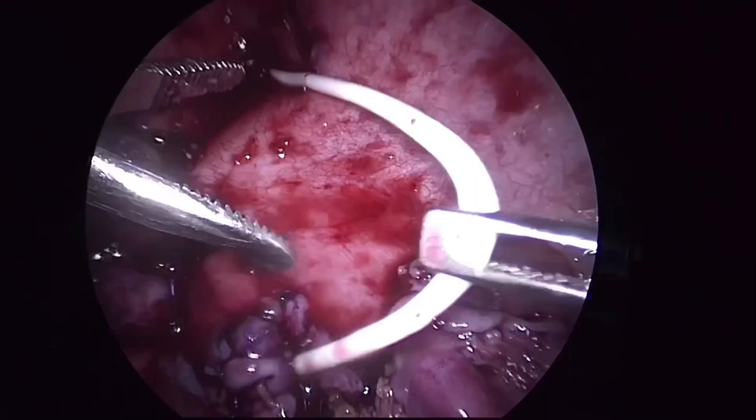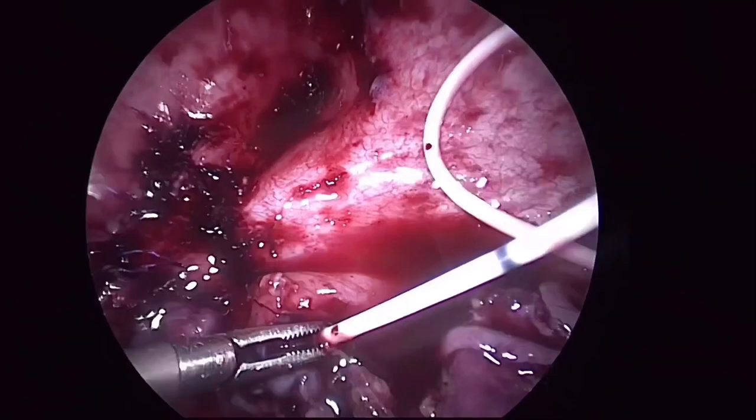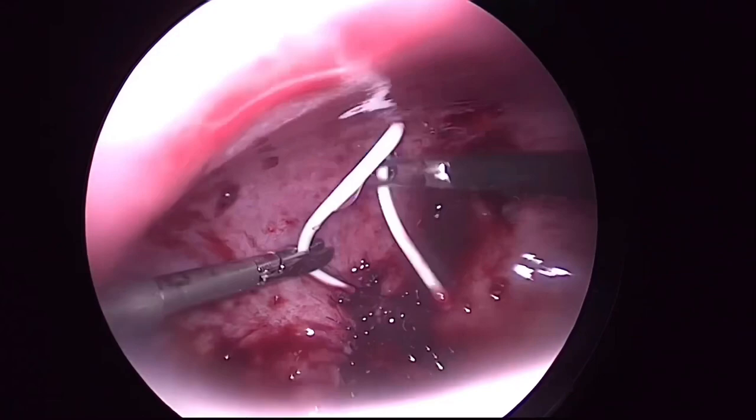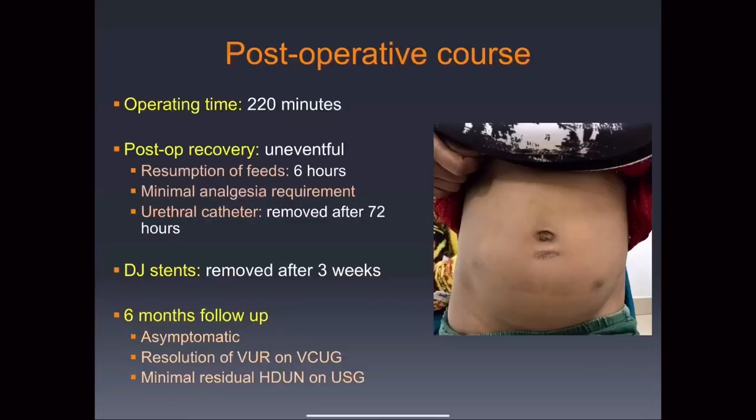DJ stents are inserted in both the right and left ureters and a thorough wash is given. This is the final reconstructive image. A Foley catheter is inserted per urethra.